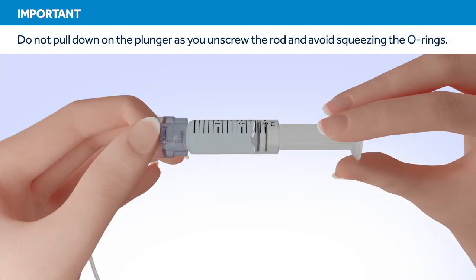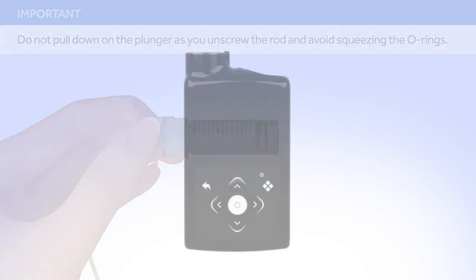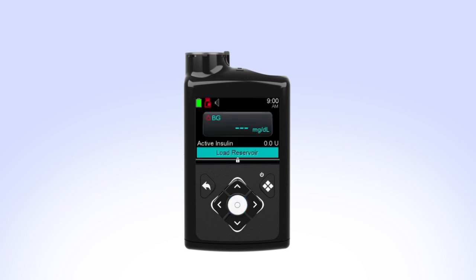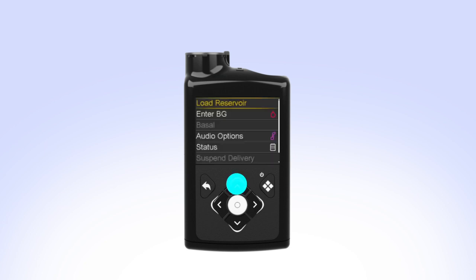Unscrew the plunger rod counterclockwise until it completely separates from the reservoir. While you are filling your reservoir, the backlight may have turned off. Press the Select button to turn the screen on again. If your pump is locked, press Select on the home screen. You will see the unlock screen — press the arrow that is highlighted to unlock the pump and continue to the next screen.